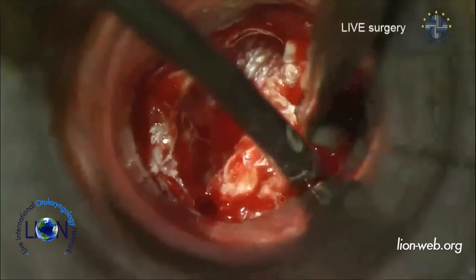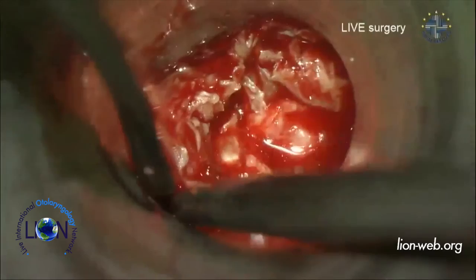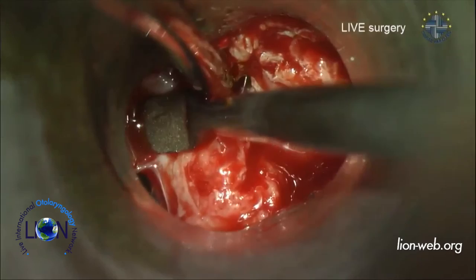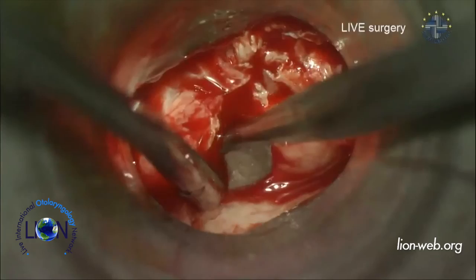Okay, so yeah, of course here, in this case, the flap will be more easy to elevate because she's been operated several times. So usually if the skin is not atrophic, then it's thick enough to find the cleavage plane. There's some lack of bone on the left, I can see that, so I need to see whether I'd be able to place the MRP some 11 o'clock or at 6 o'clock, so we need to see that.